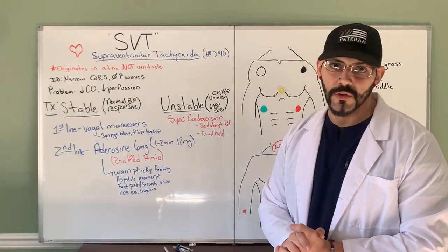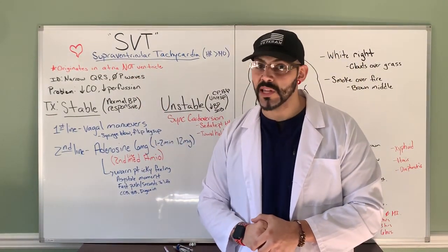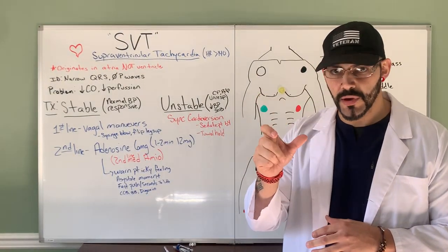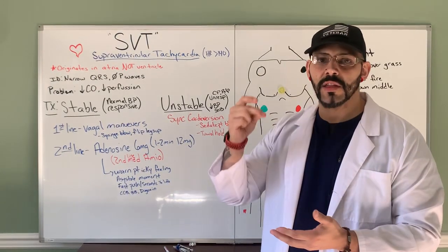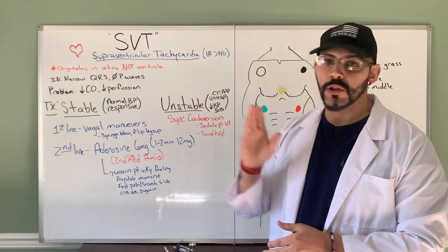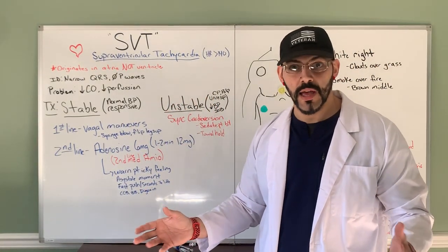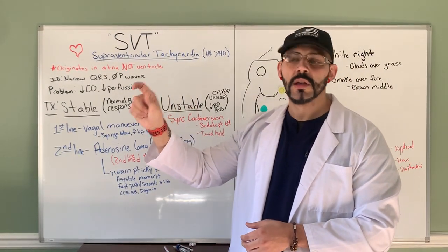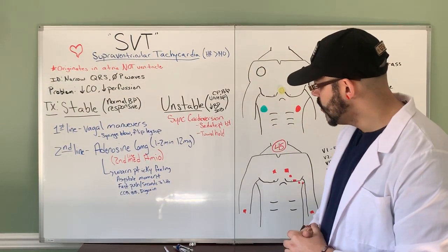Another thing you wanna look out for, and anybody who knows adenosine knows to watch the monitor right when you push the medication, is because you're gonna have a very short asystole period, okay? It should only last a few seconds and then the heart rate should restart right back into normal sinus, okay? But if you don't know that, you might get alarmed and start screaming and yelling, oh my gosh, what's going to happen here? But just know that you may have a very short, brief asystole period before the heart rate starts up again, right? What else do we need to know here?